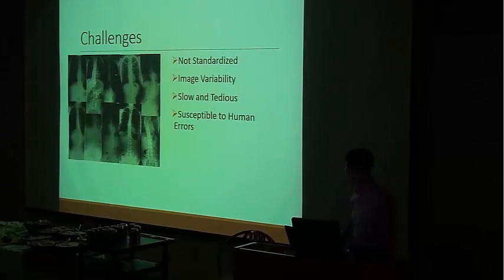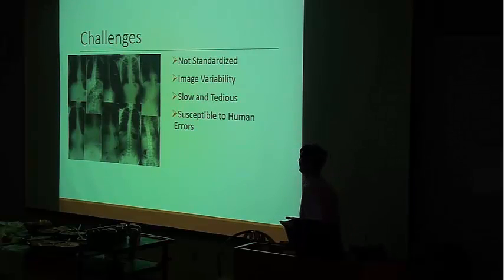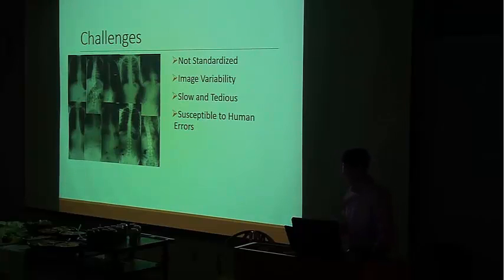Of course, this task is very challenging because the X-ray images are usually not standardized, meaning that there's a lot of variability in both the image intensity and the quality of the images. And as you can imagine, trying to find the most tilted vertebra is slow and tedious and very susceptible to human errors.